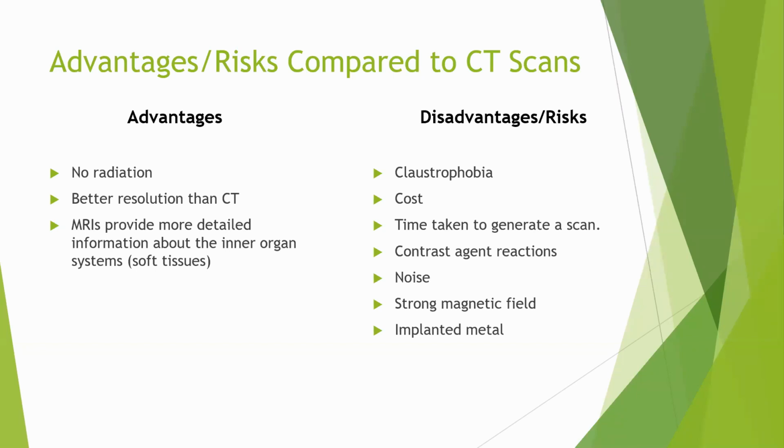It is not enclosed. But there is a disadvantage. Open gantry or standing MR scans have low resolution, and low resolution means very poor image quality. But hopefully with time, with advancement in electronics, information technology, software and hardware, we'll get there at some point, but right now it doesn't have good resolution.